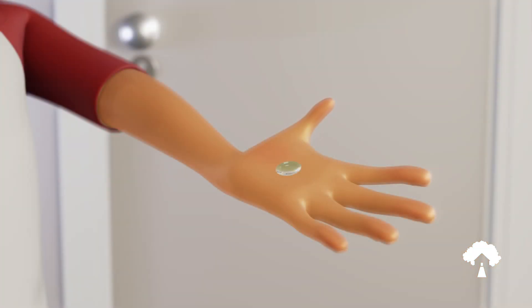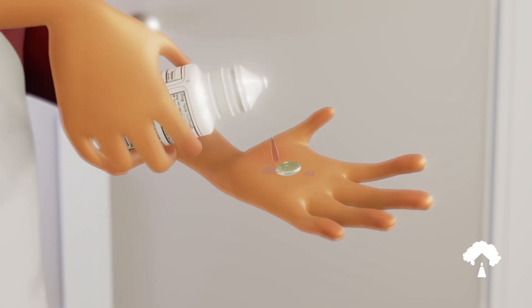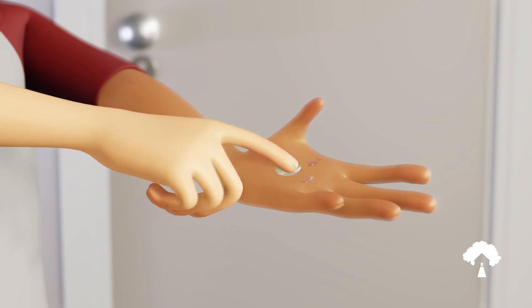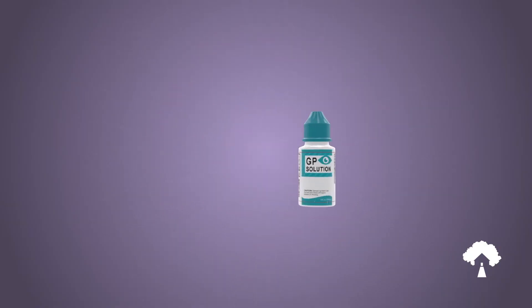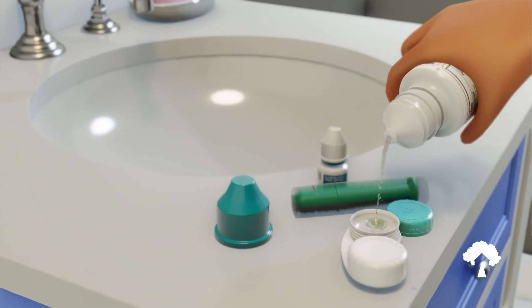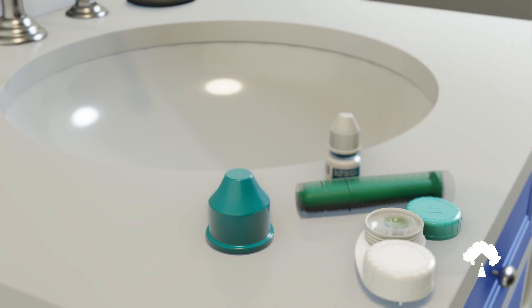Lift the lens away from the insertion and removal device. Place the lens in the palm of your hand with the bowl of the lens facing upwards. Place a few drops of your approved cleaning solution directly onto the lens. Use your index finger to gently rub the lens in a circular motion for approximately 20 to 30 seconds to clean the lens. Rinse the lens with saline or gas permeable solution. Put the lens in the appropriate side of your contact lens case, cover the lens completely with your approved gas permeable solution, and then close the case.